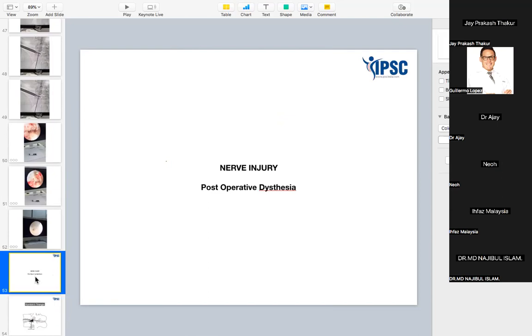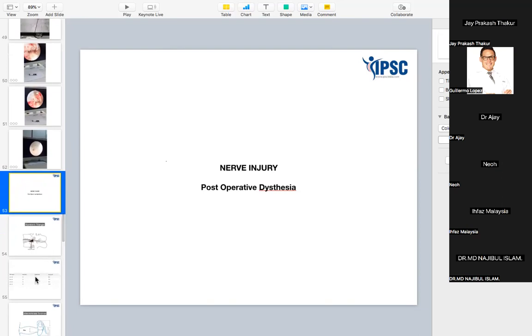So the patient will have this kind of pain when we extract this fragment, but immediately after, once we remove that, the patient will feel so happy that they don't mind this pain for a few seconds. So clear, everything's clear about the steps? Any doubt? Yes, sir. Yes, sir. Okay, good.